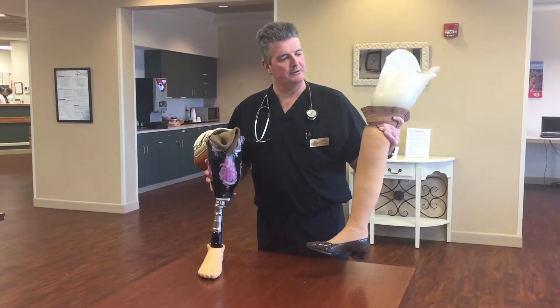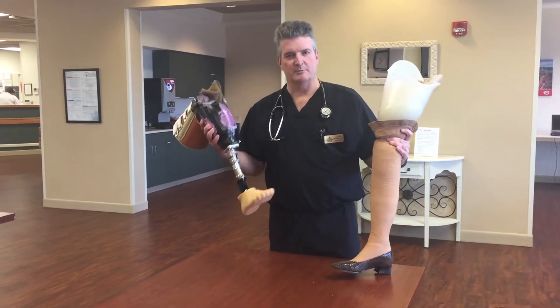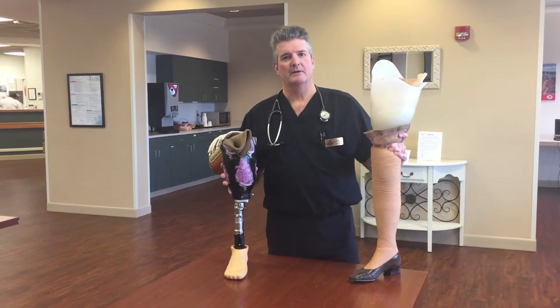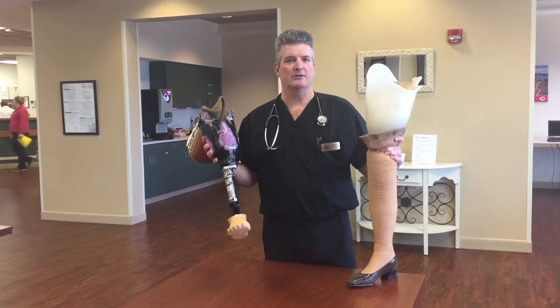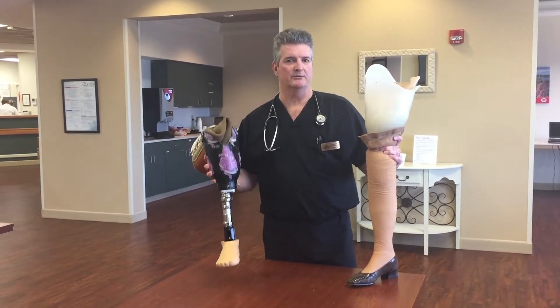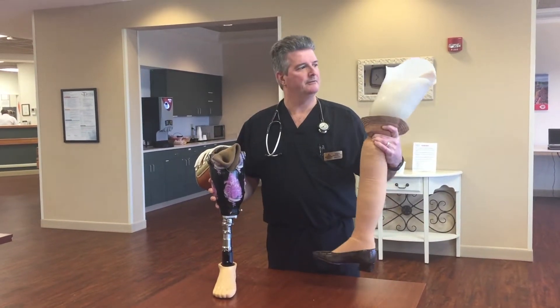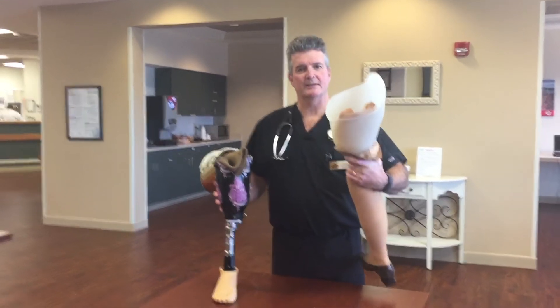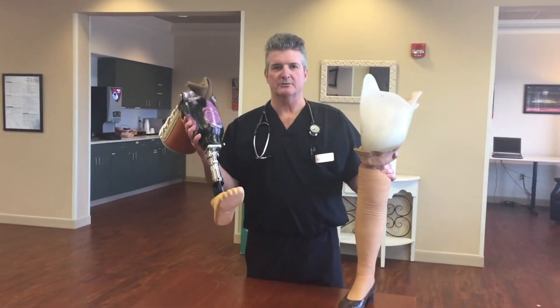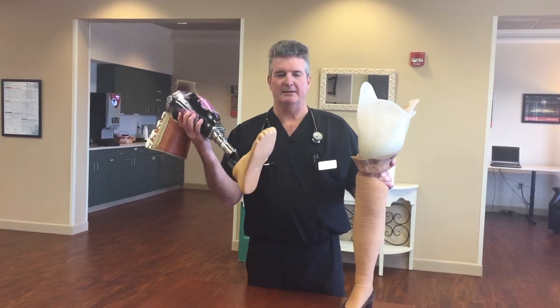I have a set of prosthetics here — one is a below knee and one is an above knee — that I discuss with patients, covering how these prostheses are fabricated and how they fit onto the residual limb once it's healed. We demonstrate the above knee's suspension and knee joint, and on the below knee we discuss suspension systems and different ankles.